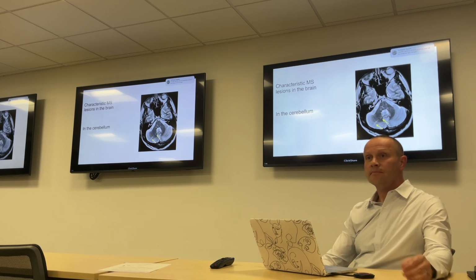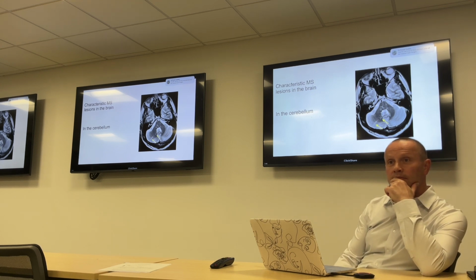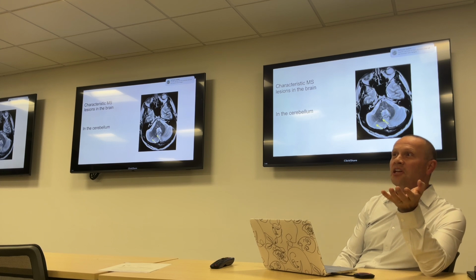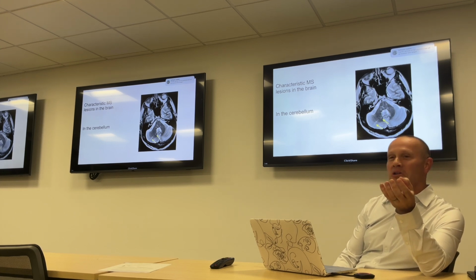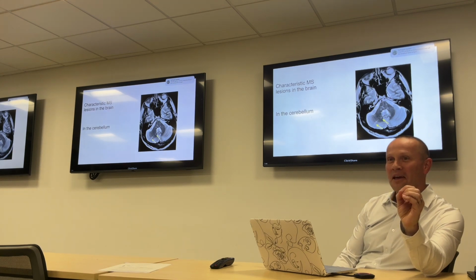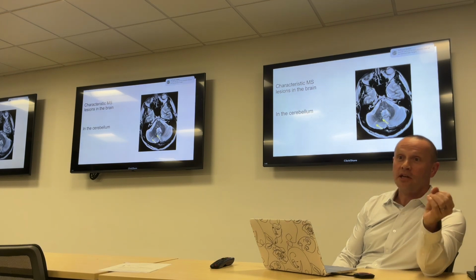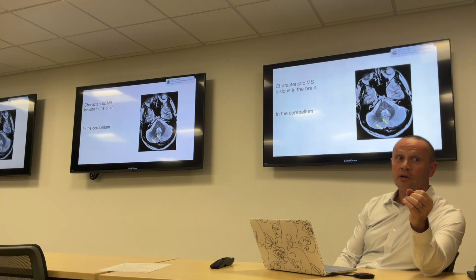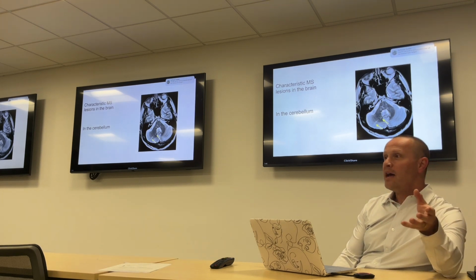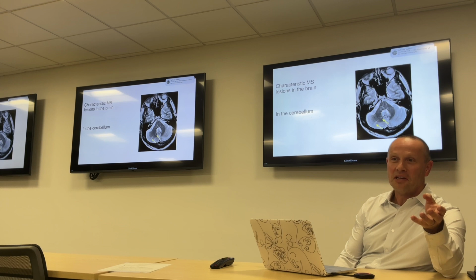I have another question, sorry. On different views, if you do cervical or thoracic, you're only looking for demyelinization at that level. You're not seeing lesions, correct? Well, when we use the word lesion, it's because we don't know what we're talking about. A lesion is just a little thing that we notice that isn't normal, and we're not sure what it means. It could be just an innocent little spot that everybody gets when they get older, or is it an MS plaque, or is it a tumor, or something like that. So a lesion is a grab bag word for when we don't know what something is.